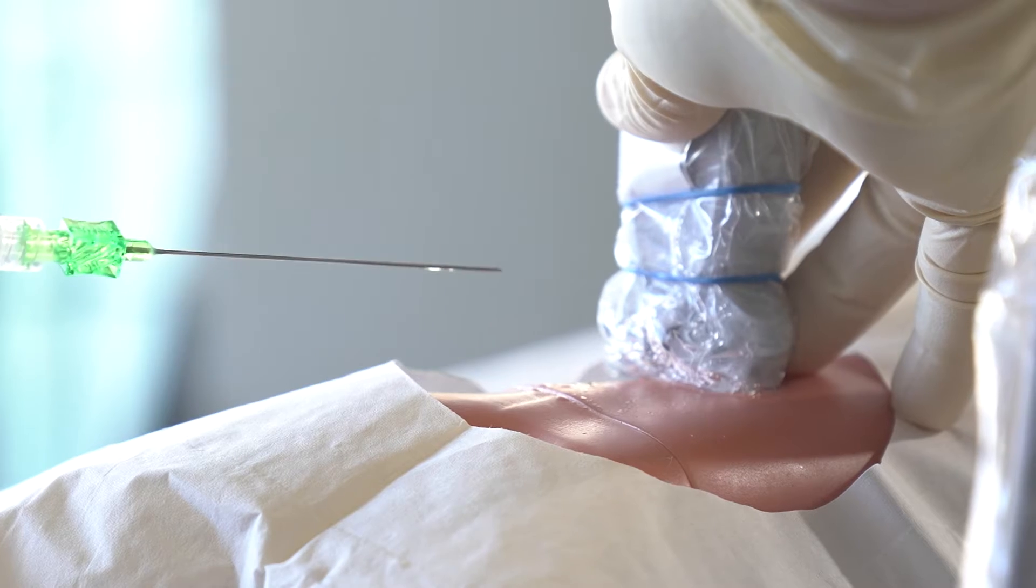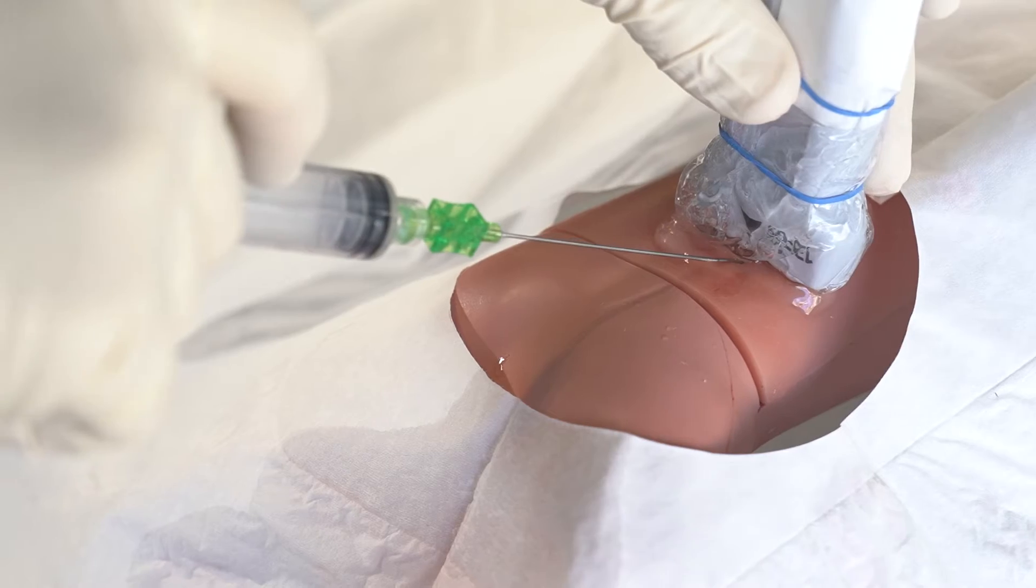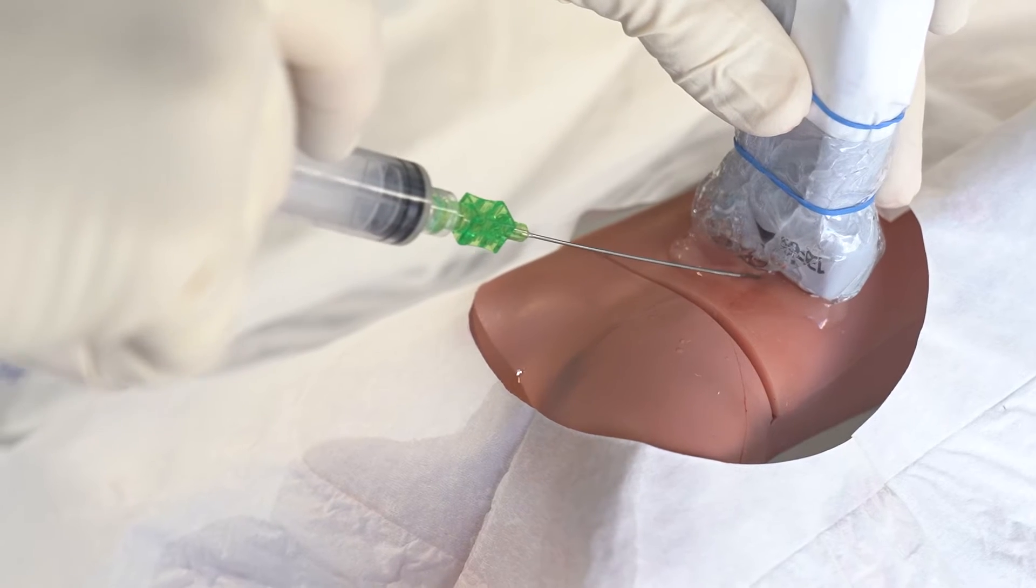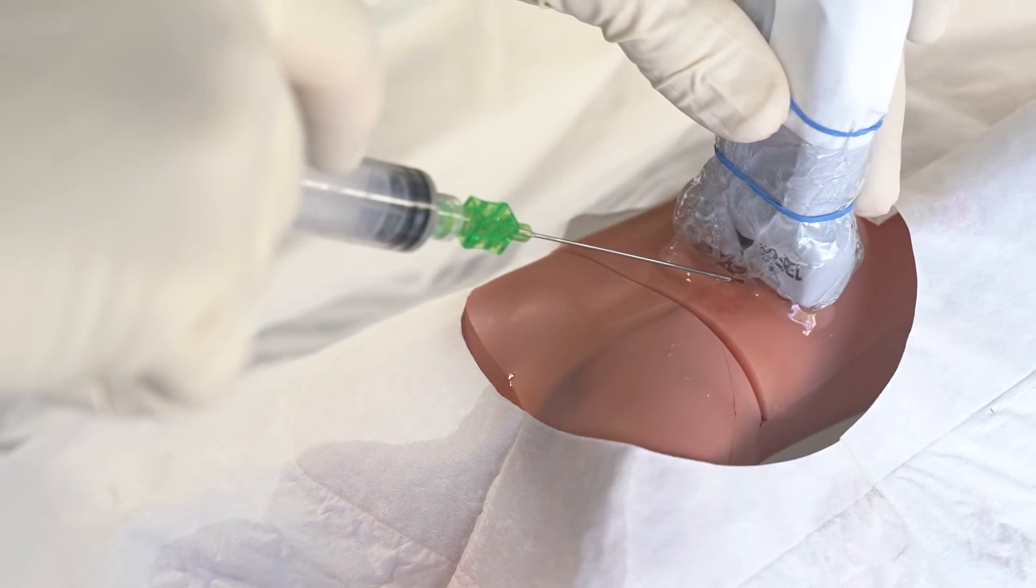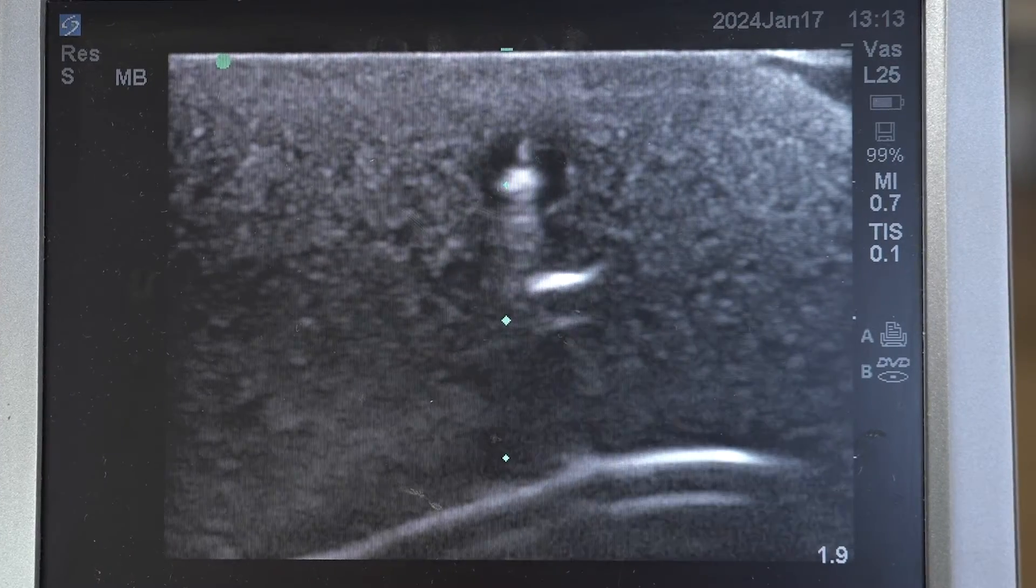Under ultrasound guidance, advance the micropuncture needle through the skin at approximately a 45 degree angle, ensuring the needle is placed with the bevel facing up. Follow the echogenic tip of the needle as it is advanced.